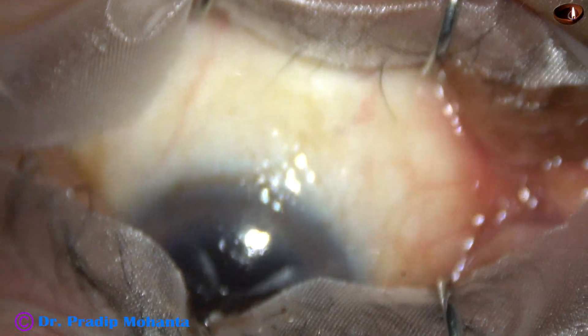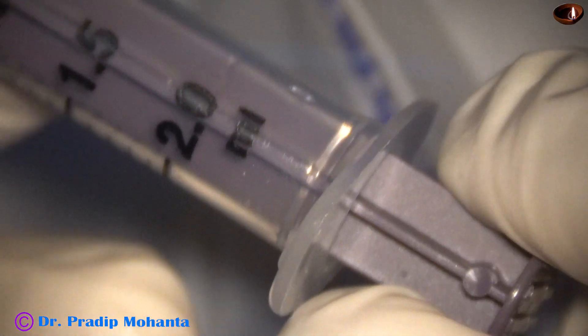After applying the speculum, povidone iodine 5% is instilled over the ocular surface.